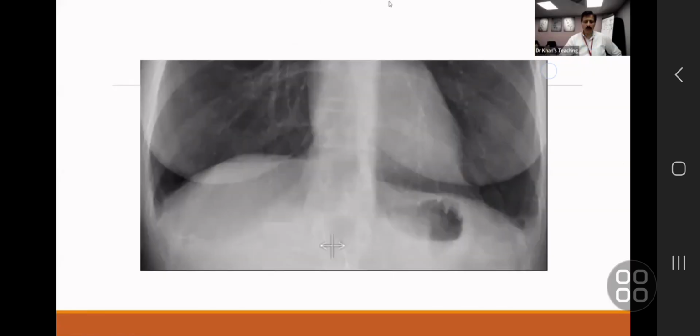Samavia, before you begin, in the current era, do you do the apical view? Somebody is asking if you find it useful. Do you do it? Over to you. Absolutely not. I think we need to move away. Most of us have moved away.